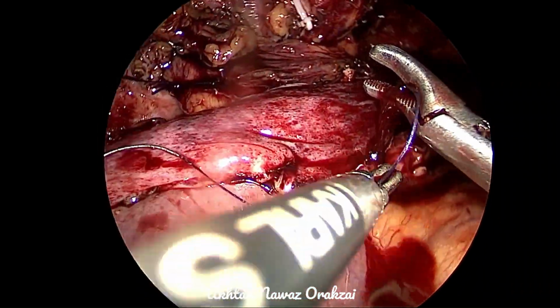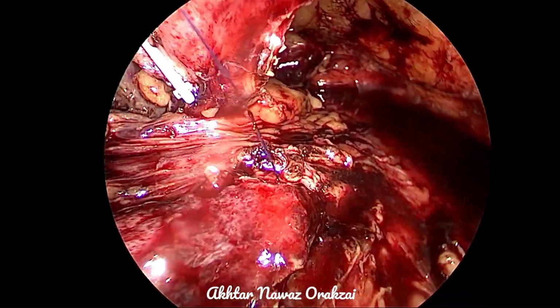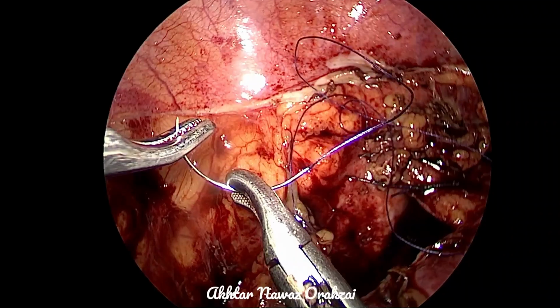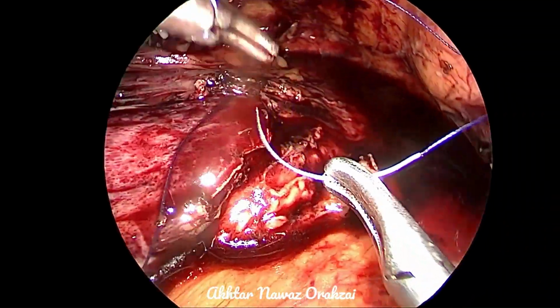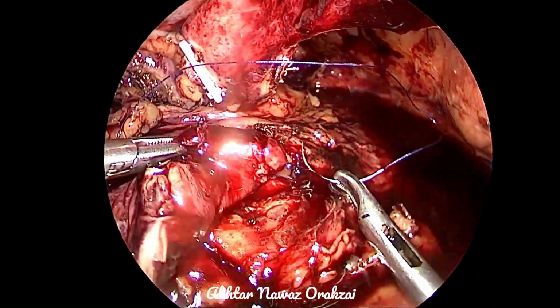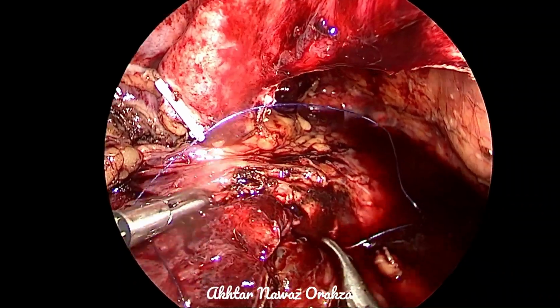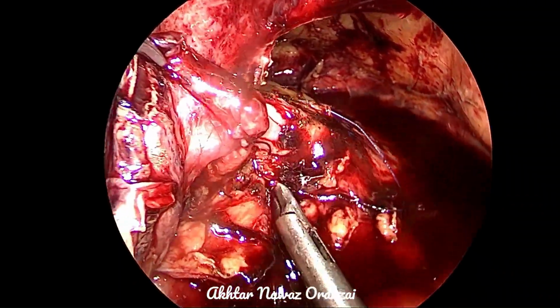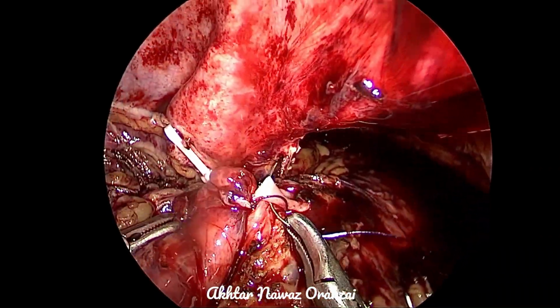It is important to take this needle away because we will take another suture and these needles may be confusing. Here you can see that the needle has come to our field again. So this corner stitch is important. Careful not to take the opposite wall. Now it is clear.